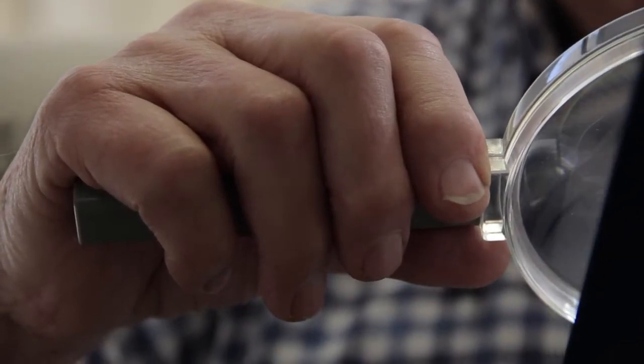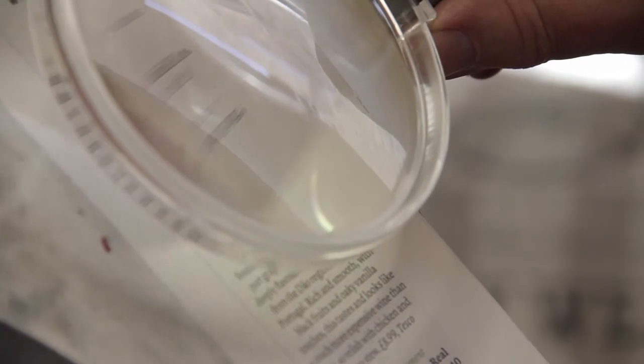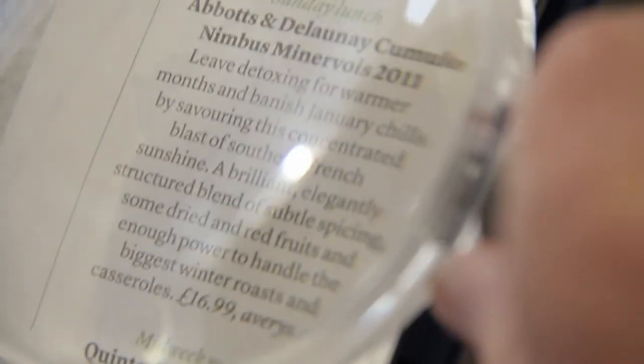And with a clipboard it's best, because then if you're reading print, it keeps it steady while you move the magnifier up and down until you reach the right focus.